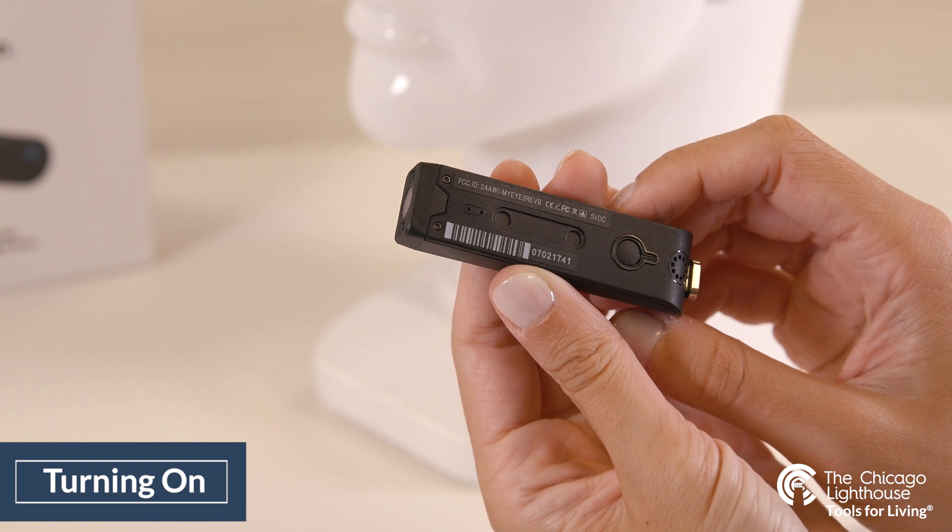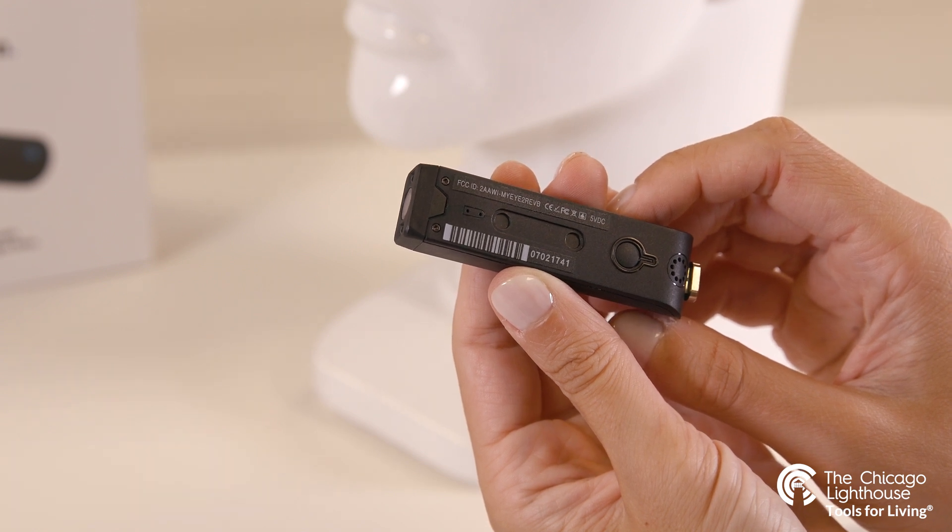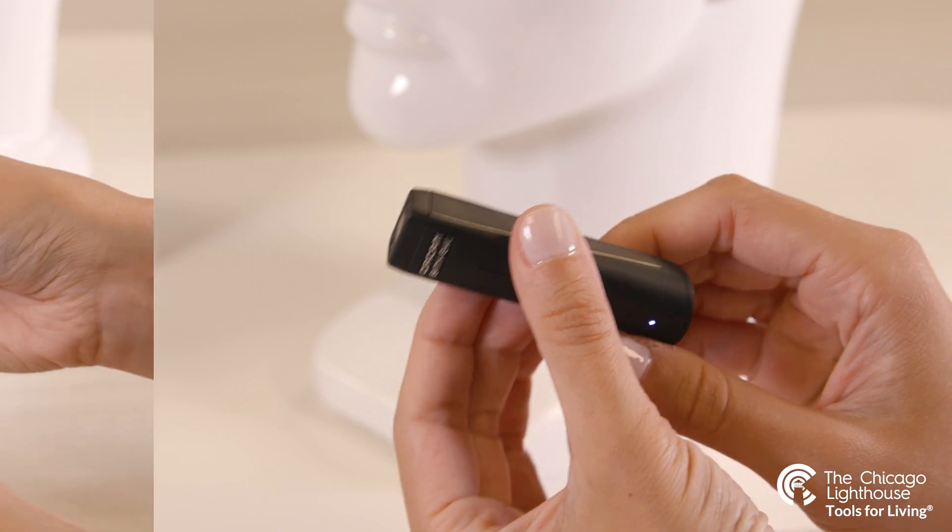OrCam MyEye version 9 is ready. Battery is 77% charged.